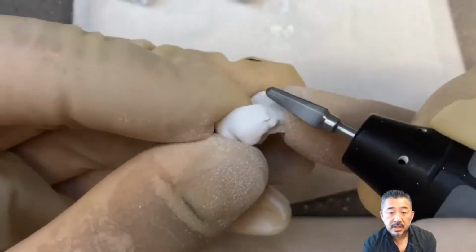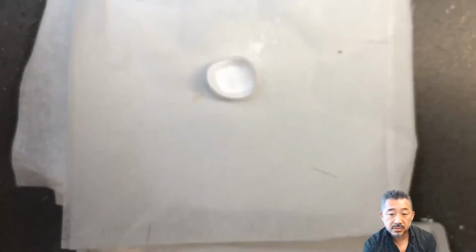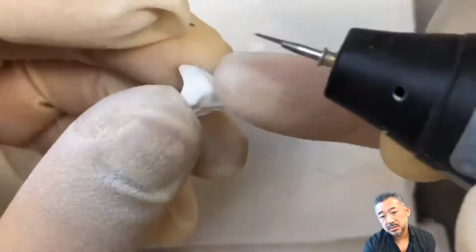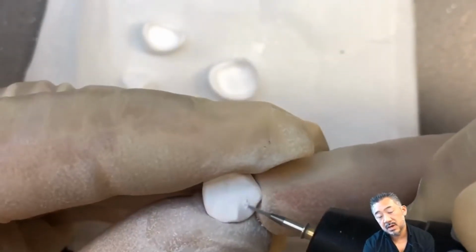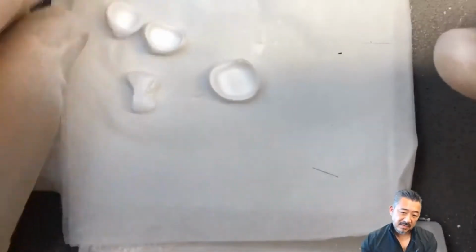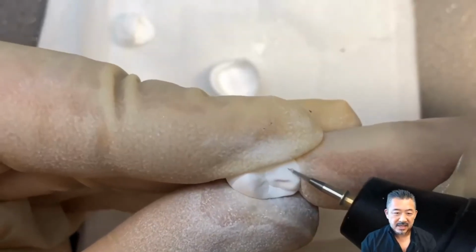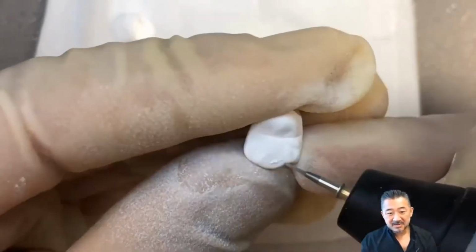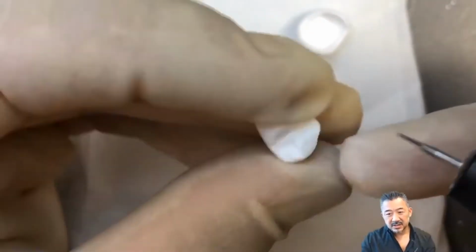So next, use a fine bar to slightly cut the deepest part of the occlusal surface of the molar teeth. Well, this may not be necessary. It depends on the case. Actually, this is rarely needed. However, if your milling machine isn't very accurate, you may need to do it, right?